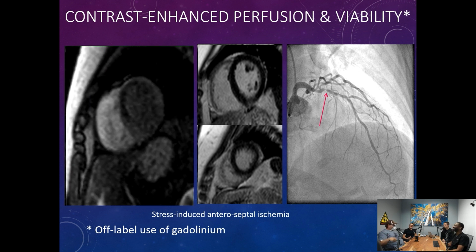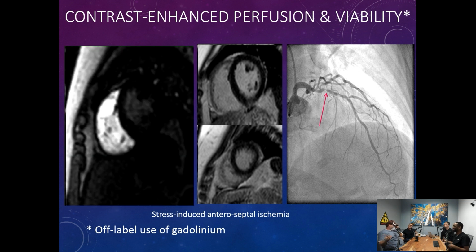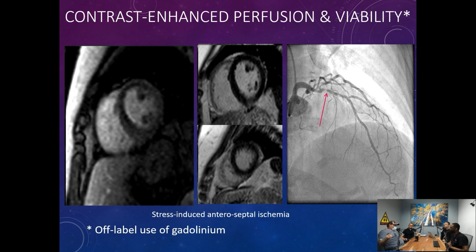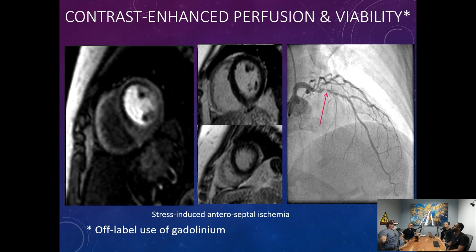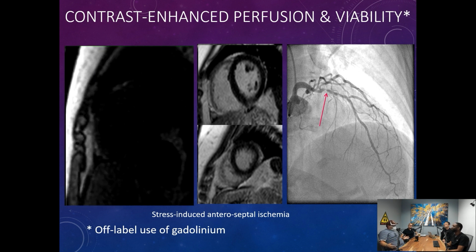You're trying to set the TI and you're like, this looks weird. Like, this doesn't look right, right? Because there's no contrast. Yeah. Like, should I chase it? The other part of that, too, is amyloidosis. It can be very focal, but it's usually a very diffuse process. Right. You need to have some normal myocardium somewhere to decide, this is what we're going to try to null. If you don't have any normal myocardium, if it's all chock full of amyloid, what do you null?